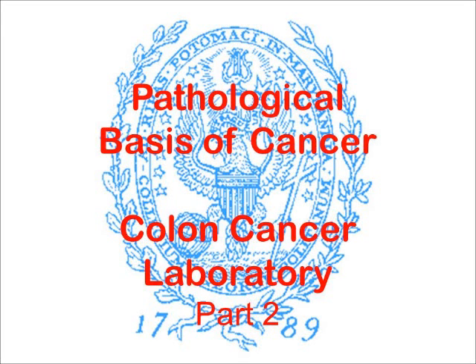This video is part 2 of the colon cancer laboratory, in which I will describe the individual slides and indicate the structures of interest. As you look at these slides, I would like you to keep in mind the staging of colon cancers by observing the landmarks which they have passed.